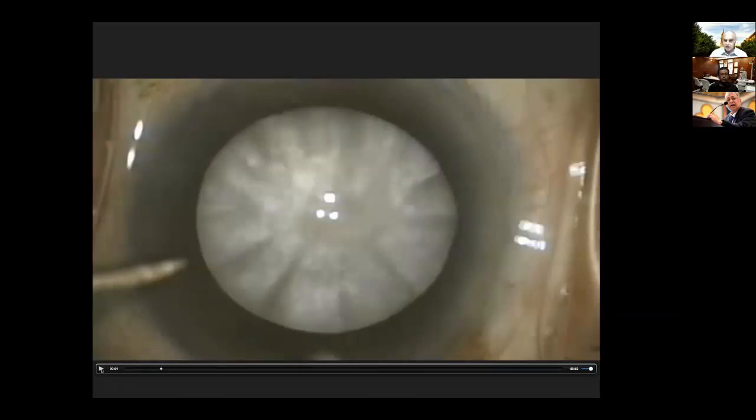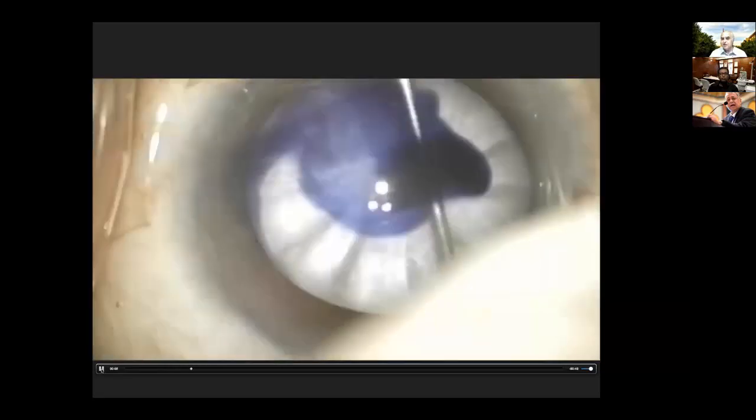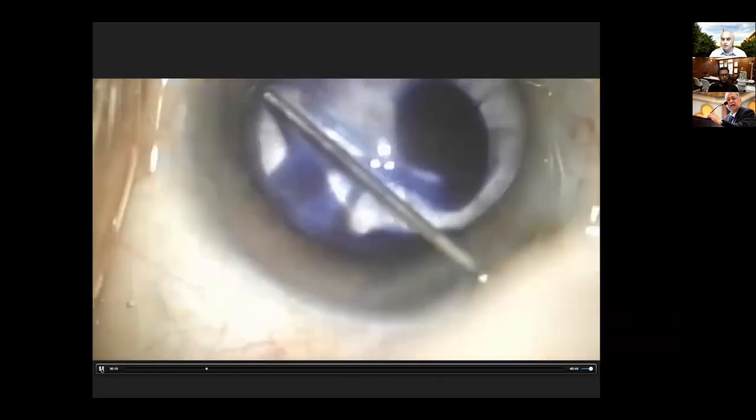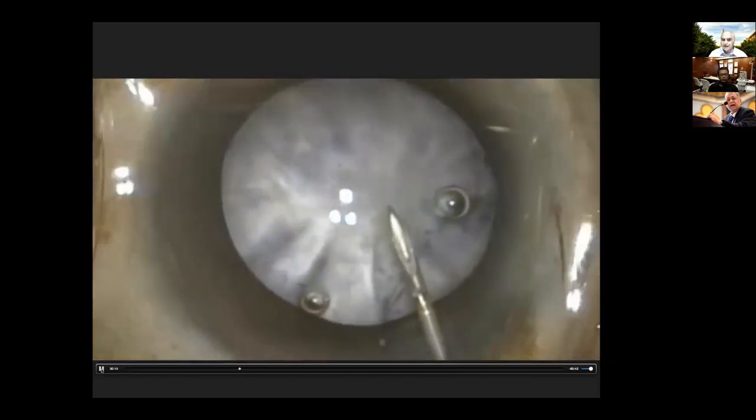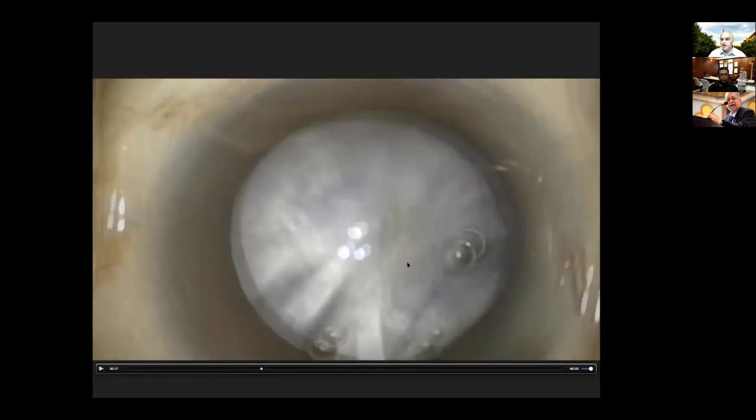So you have to fill the anterior chamber with viscoelastic. Of course, capsular staining is important. I do it under viscoelastic, massaging under the capsule. Here is the most important step. At the beginning, you make a curved cut.